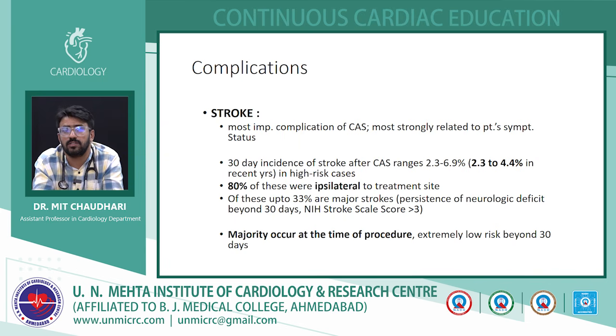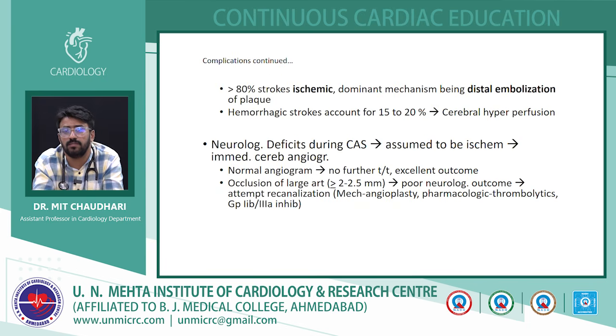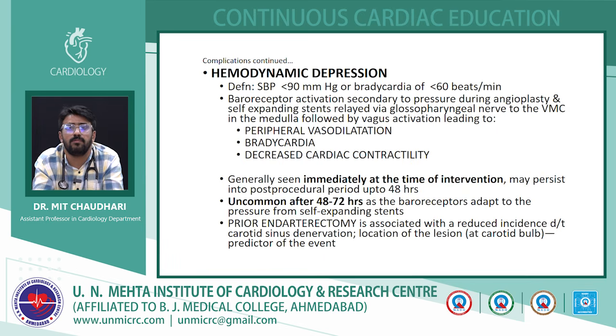Many of them are ischemic strokes, but the patient can also develop hemorrhagic stroke. Mostly they occur at the time of the procedure or within the 30 days, but mostly in the perioperative period. They are due to distal embolization, but hemorrhagic strokes are also explained because of cerebral hyperperfusion, which we will discuss in the next slide.